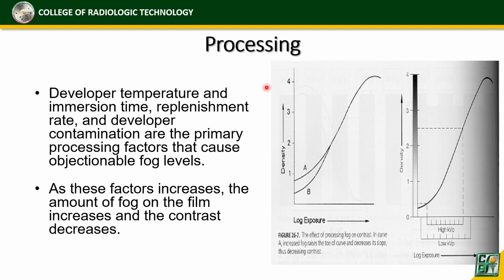Okay, processing. So developer temperature and immersion time, replenishment rate, developer contamination, yan yung mga primary factors. So kapag sa manual, nakokontrol natin ang contrast and density. Kasi pwede natin silipin under the safe light yung ating radiograph, kung may image na. Okay?